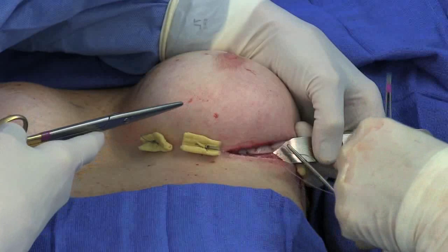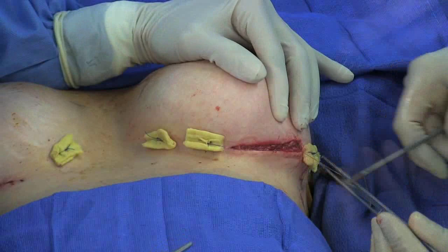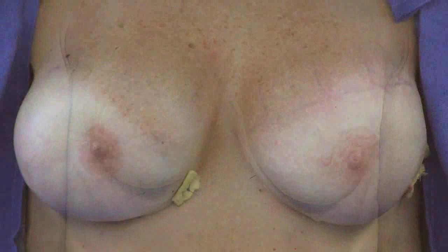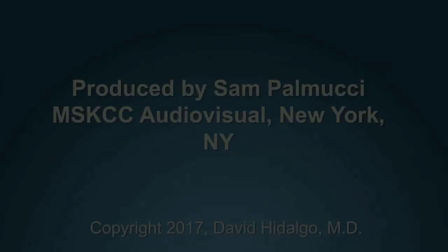The incision is then closed in layers. Here is a view of the patient before surgery and here at the conclusion of the procedure. The yellow bolster sutures and drain are removed one week later.